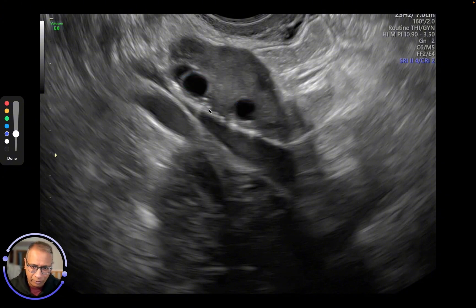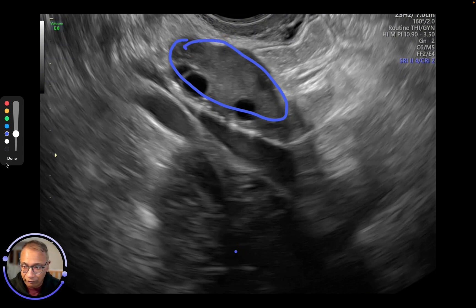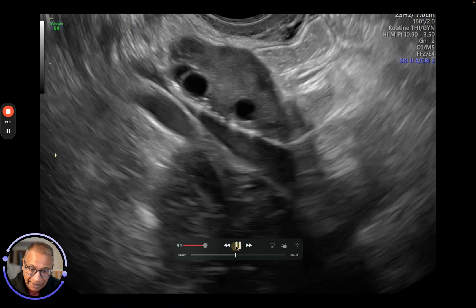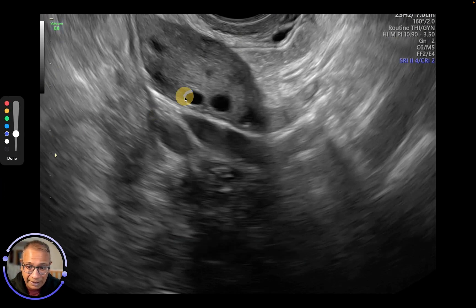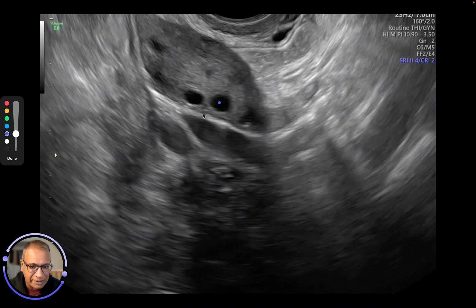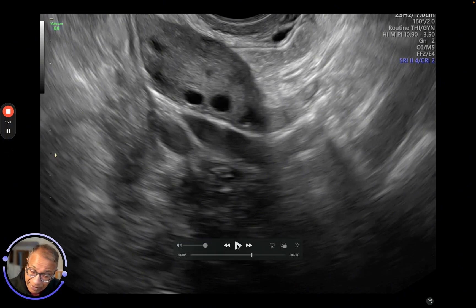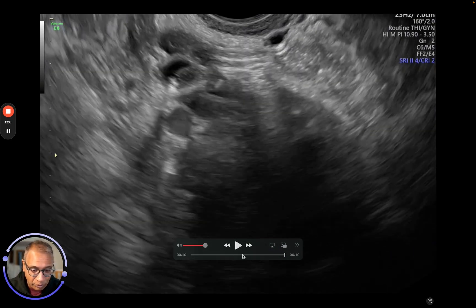What do we need? First, you need numbers, and second, you need size. Follicles that are very small — this being the ovary — are less likely to start growing. If you look at these follicles, the bigger ones are the ones that will start growing when you give tablets or injections. The smaller follicles are unlikely to grow. This lady has an excellent antral follicle count.